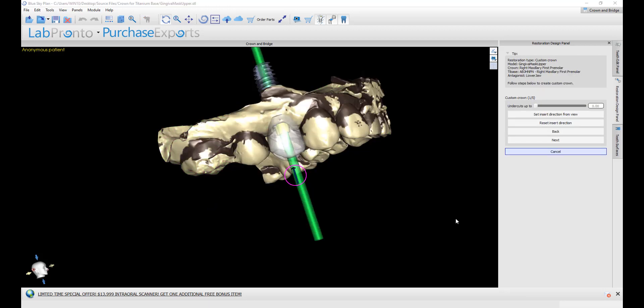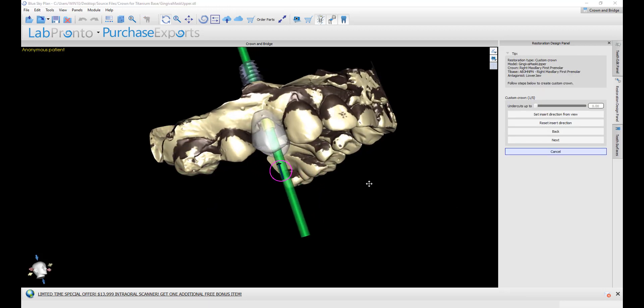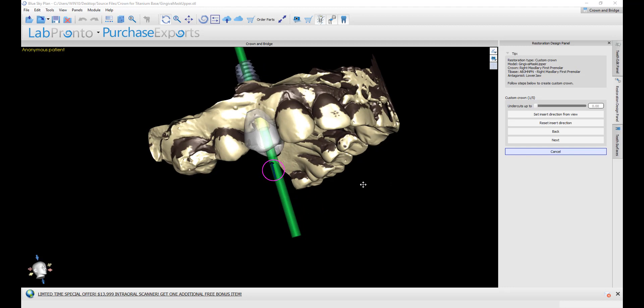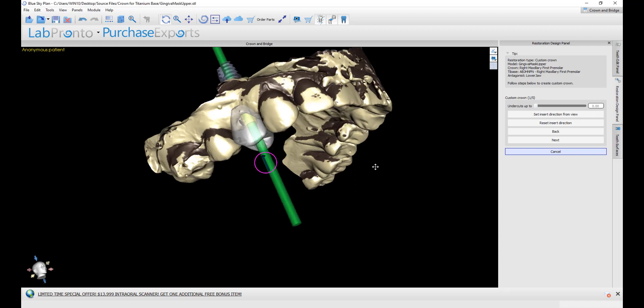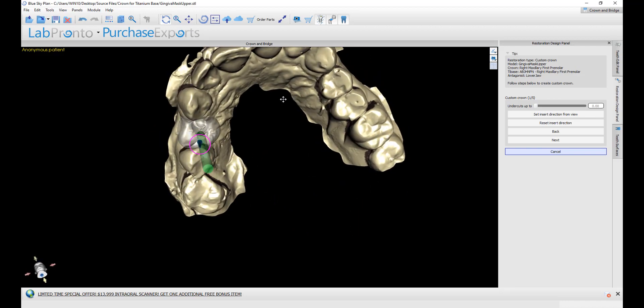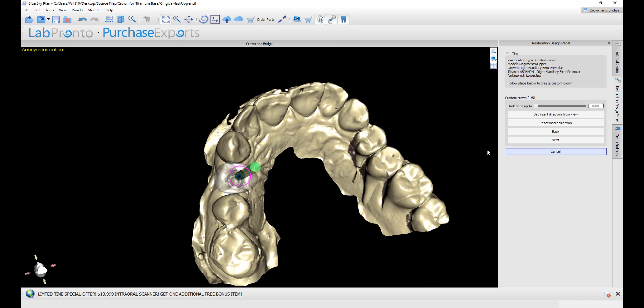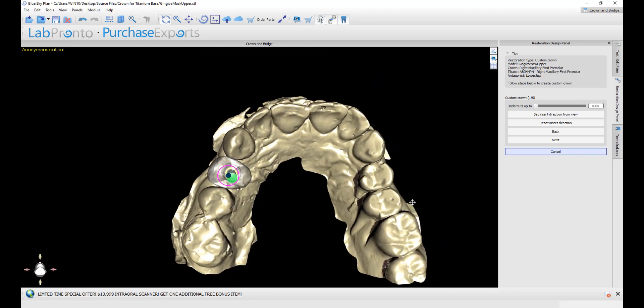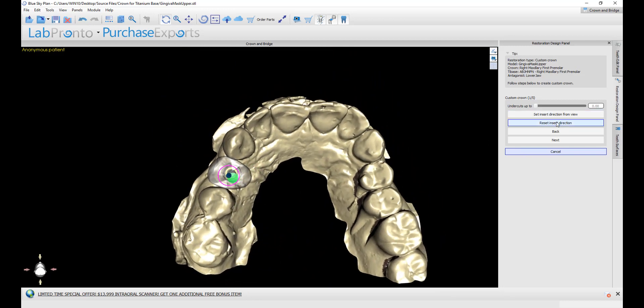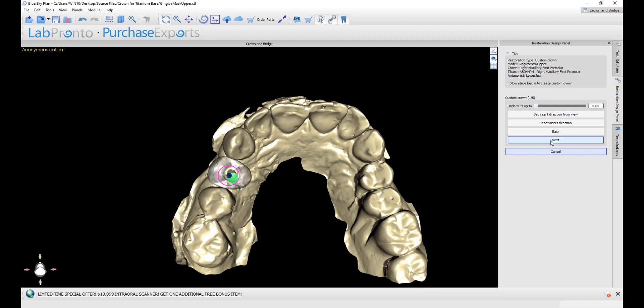We have a short five step process. The first step is undercuts. You could define the path of insertion by grabbing and rotating the arrow, or by aligning the model on screen and then clicking set direction from view. Then we're going to click next.